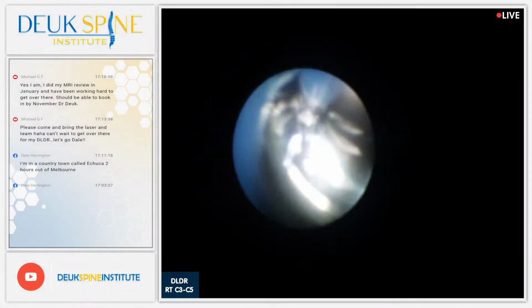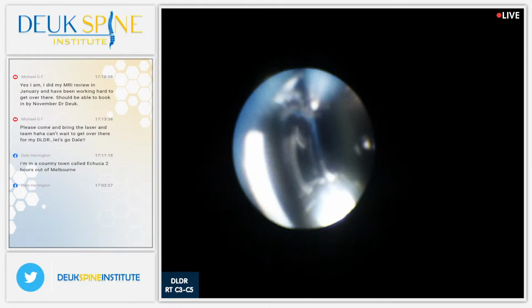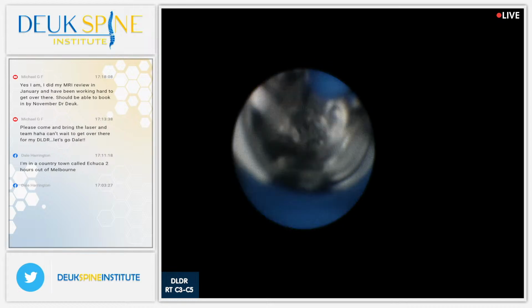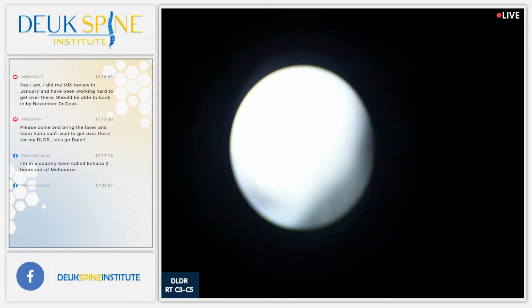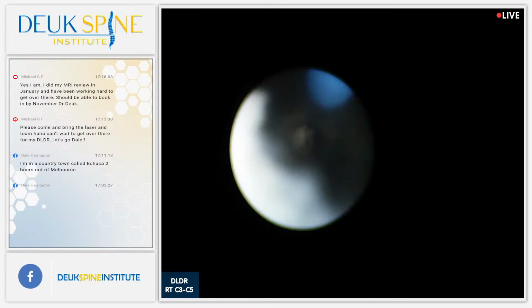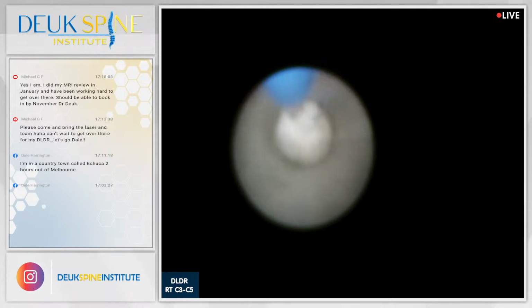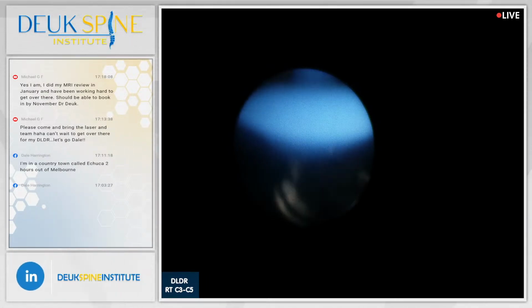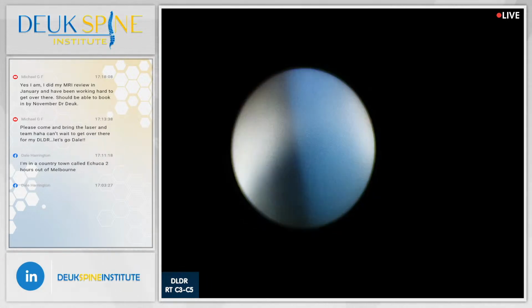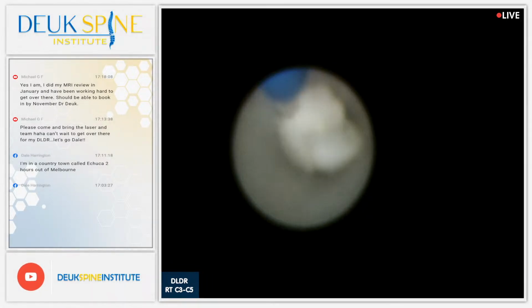Is there a kink somewhere up here, guys? What is this shit tubing we're using? Is this the new "we'll charge you twice as much, but we'll send you shitty tubing"? It may look the same, but it's not performing the same. Therefore, it cannot be the same.